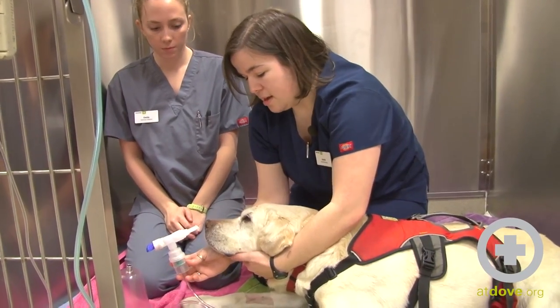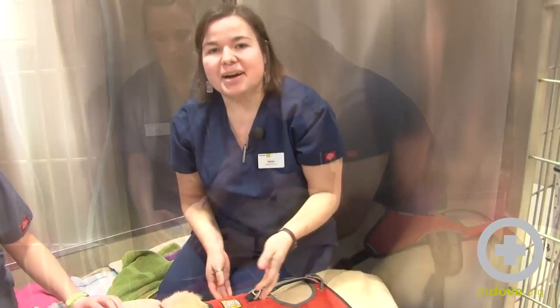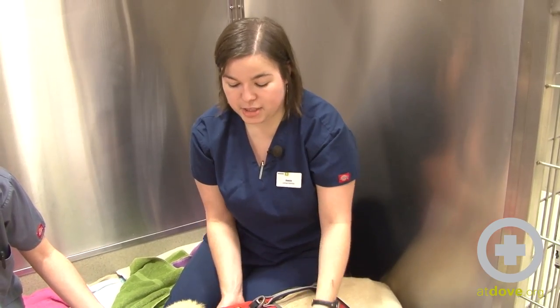It's now been about ten minutes, so we are going to switch to coupage. Coupage is named because of the cup that your hand makes when you percuss on their chest.